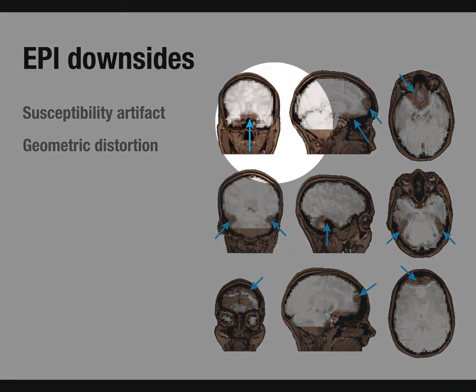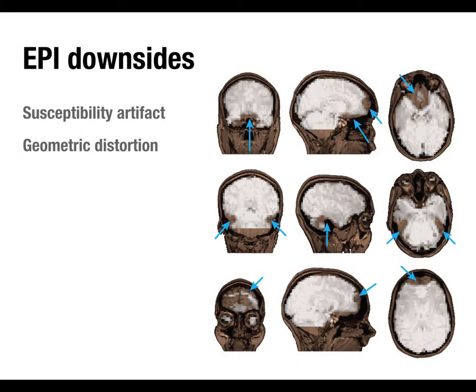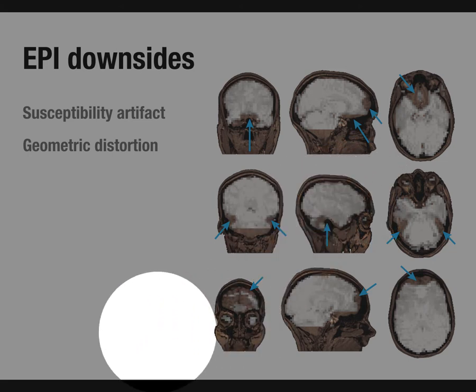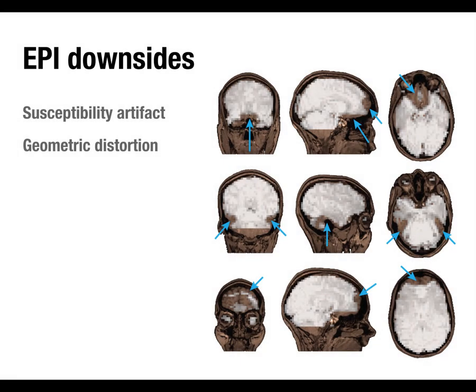And so what you see here is actually a structural MRI, that's sort of the darker image, and then the EPI image of the brain superimposed on it, which is the sort of white stuff. So you can see compared to, you can't see a lot of the brain there, but the structural is pretty rich in terms of its anatomical detail. Whereas with the EPI, you can kind of tell, maybe more when I don't shine the light on it, there's a bit of gray-white matter contrast. So you can kind of tell there's like a brain there and some of the structure, but it's not nearly as clear or as crisp as in the structural images.